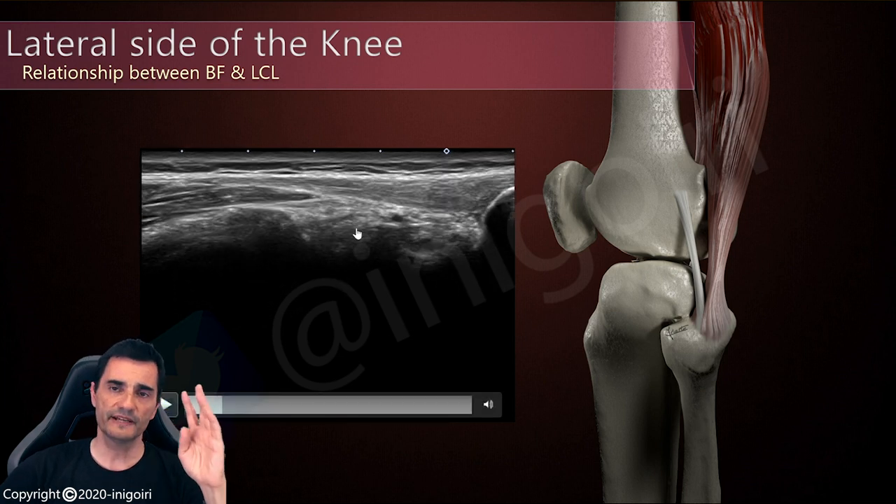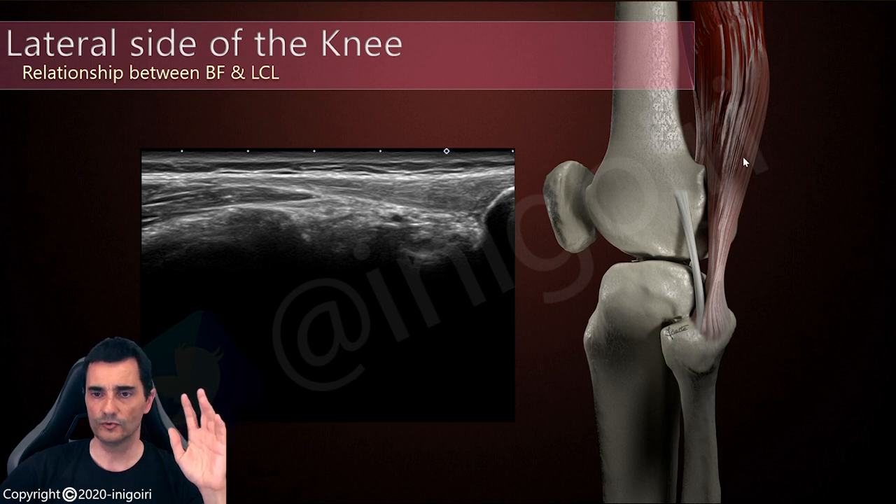The insertion of the biceps femoris is quite complex, as we have different components — three insertions on the fibula and one insertion on the tibia. But this is not the goal of this video; I only want to talk about its most important insertion on the fibula.